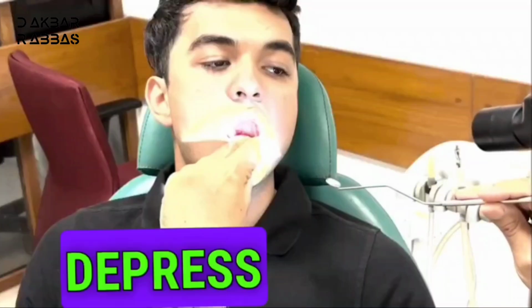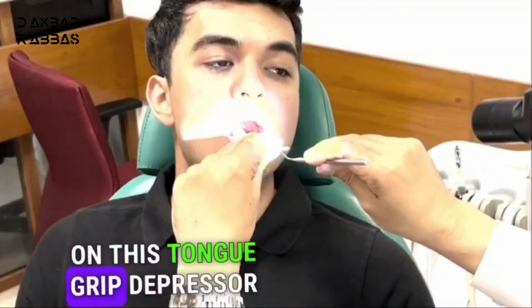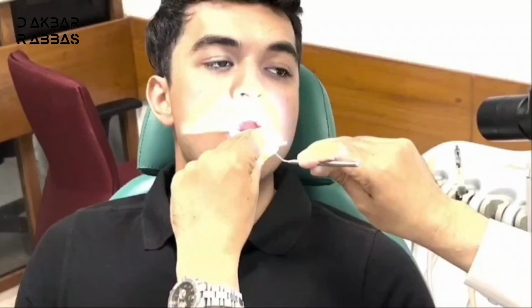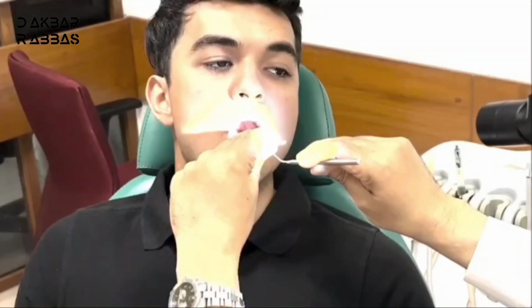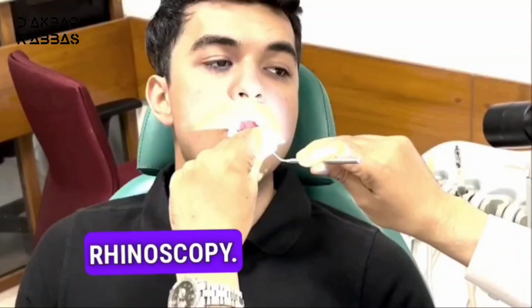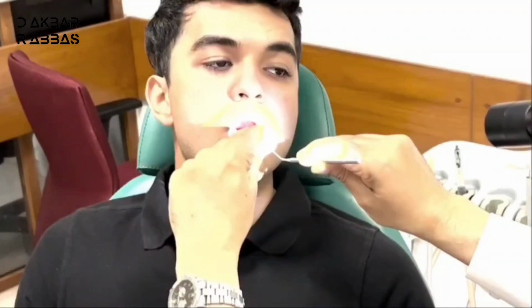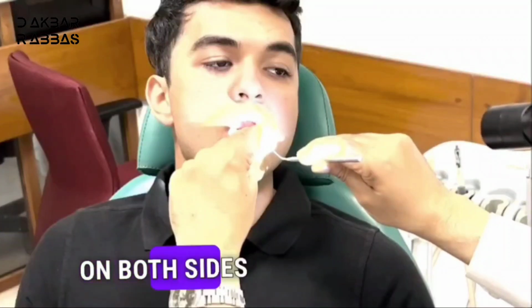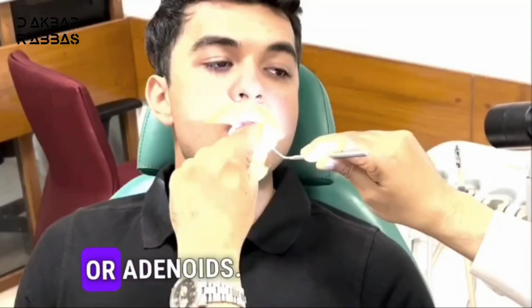So gently depress the tongue and then slide this mirror along the tongue depressor behind the soft palate. Once you are there, you will be examining the posterior rhinoscopy view. You will be examining the nasopharynx, the fossa of Rosenmuller on both sides, and any signs of nasopharyngeal growth or adenoids. So at the end of the video, we would like to thank our patient for cooperation.